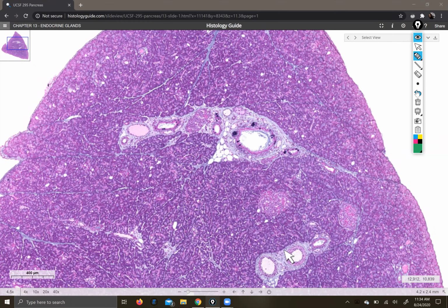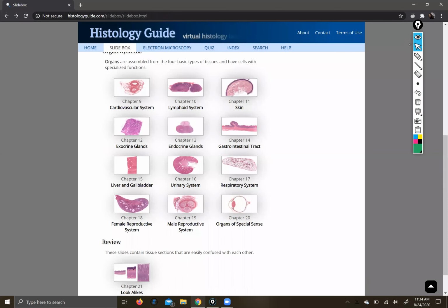Okay, so I promised you some salivary gland stuff, and away we go. Salivary glands, by the way, are pretty similar to the pancreas, minus the endocrine function, because they're just exocrine acini and ducts. So let's have a look.